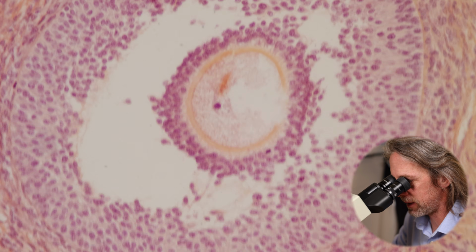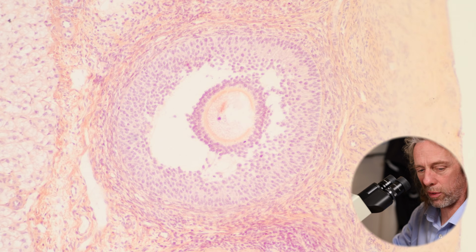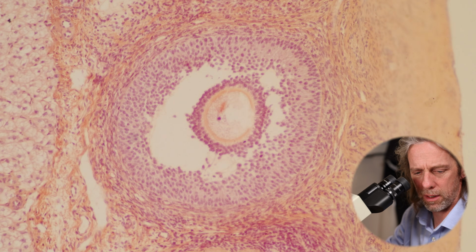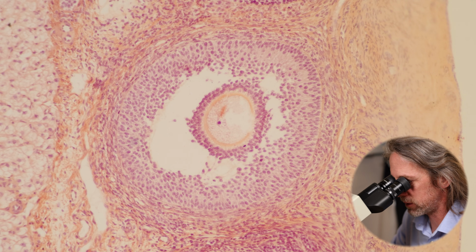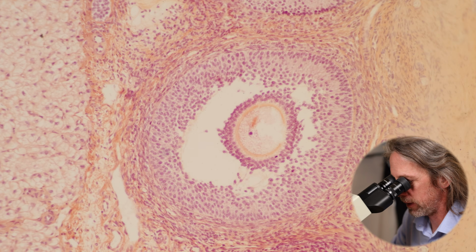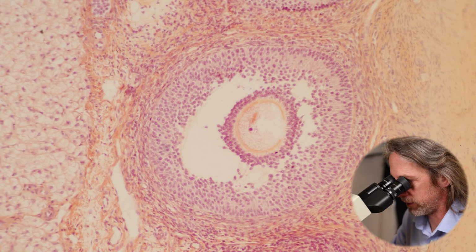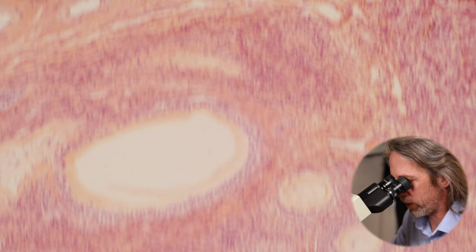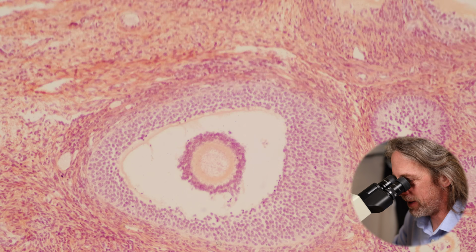Oh look, there's the next stage. As you can see, there are lots of follicles going through this process at once. This isn't a human ovary, so it's a little bit different, because some animals, of course, give birth to multiple offspring at once, whereas humans just tend to do one at a time. So look, there's that follicle continuing to develop, and there are quite a few changes there.